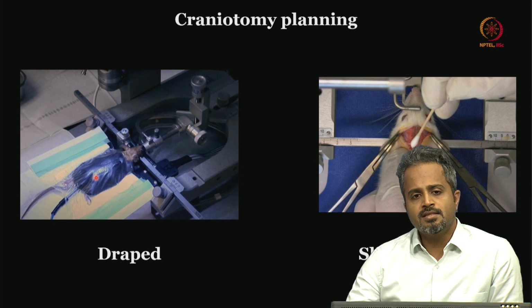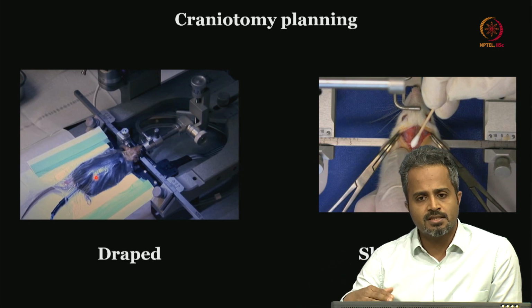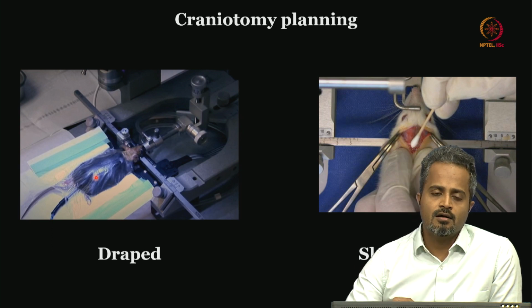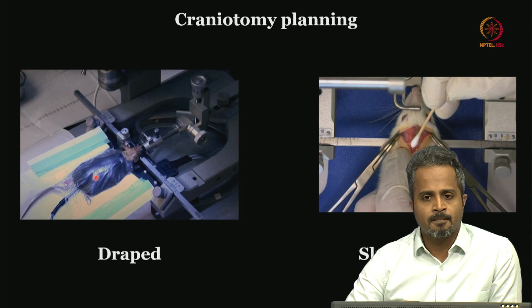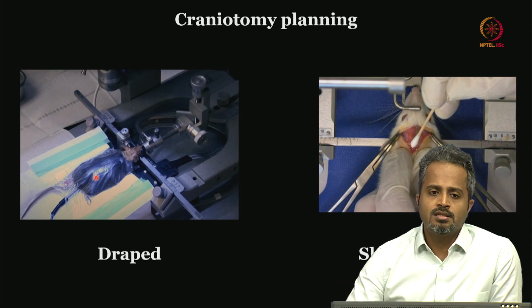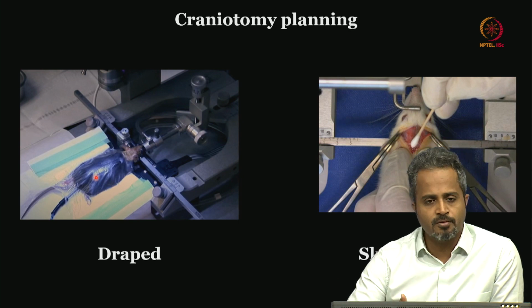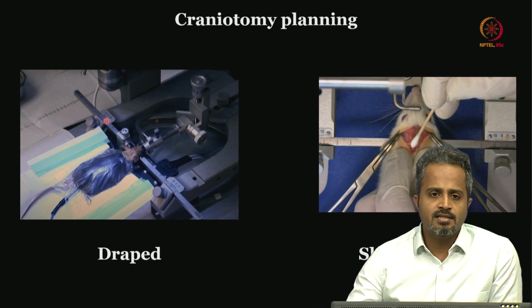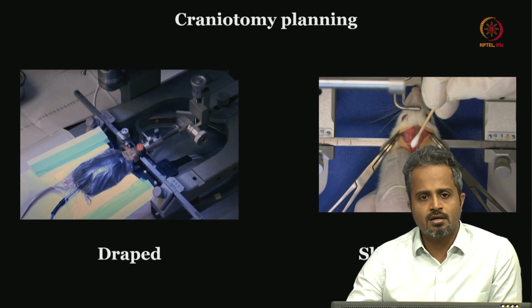Ioban. Ioban is again a plastic transparent sheet with an adhesive layer in which the betadine or povidone iodine antiseptic agent has been impregnated. So that's best, and that is what we use in human neurosurgeries. But I guess Opsite will do the job, and on top of this, if you are draping for a small animal, this should do. And that is the classical positioning for the craniotomy.